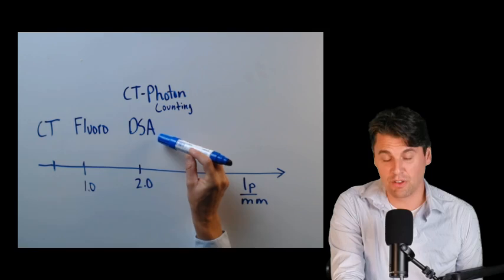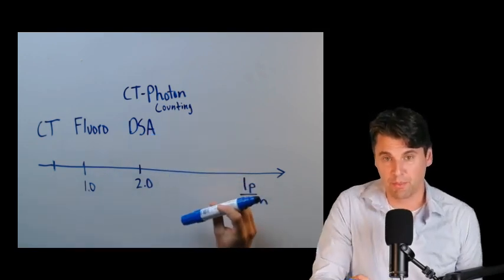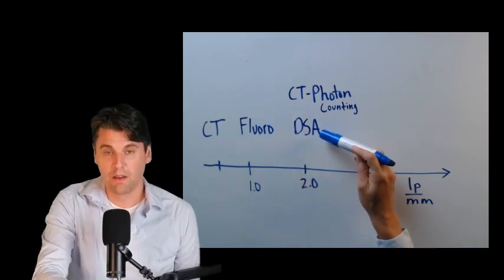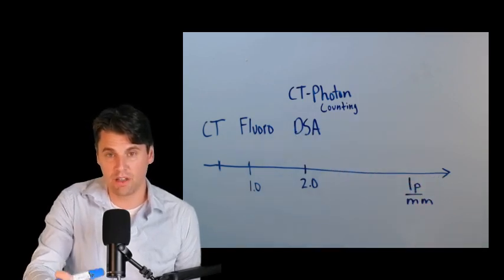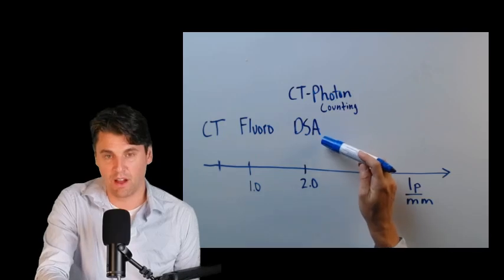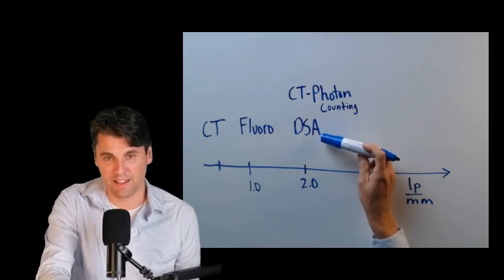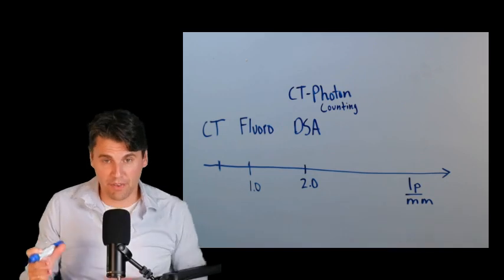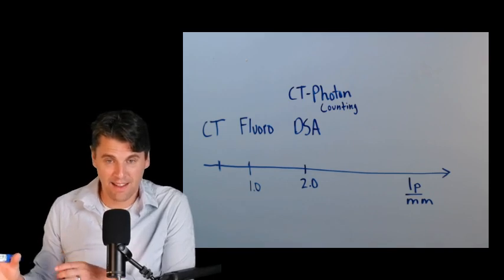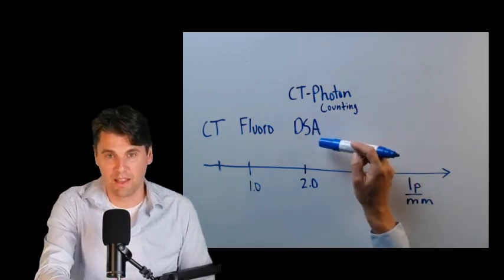As well, on a digital subtraction angiography acquisition, you can be in this range of 2 line pairs per millimeter. These can be taken on the same systems that do the fluoroscopy, but these are a higher dose acquisition where you're more concerned with the spatial resolution. You can be reading the images off at a higher matrix and getting a higher spatial resolution on your DSA. There also can be magnification modes, either optical in the case of an II, or electronic in the case of the flat panel system, that can be used in DSA.